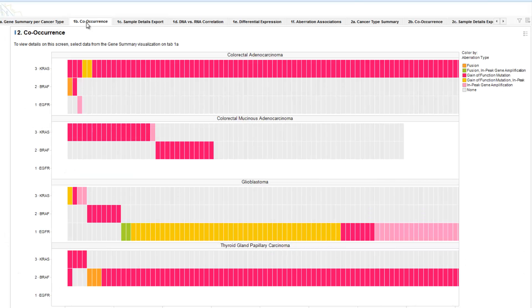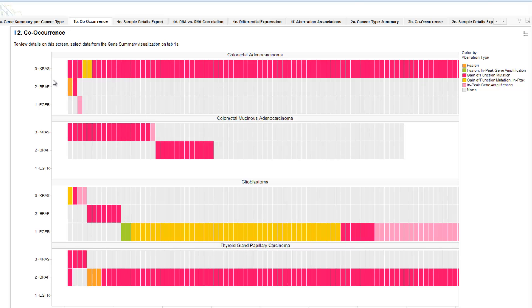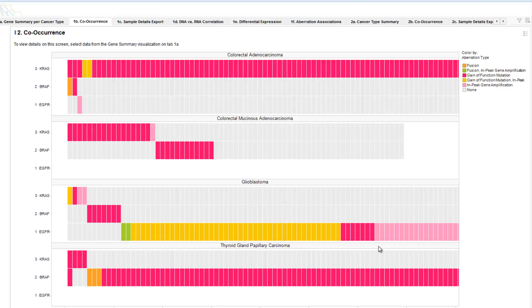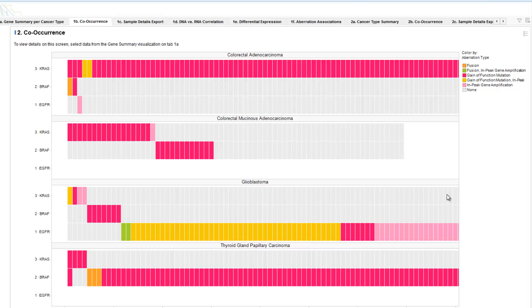Selecting the co-occurrence tab, we can now see across the cancer types that we selected, specific aberrations as indicated by the color for KRAS, BRAF, and EGFR on a per-patient basis. We can then see, for example, KRAS mutations and other aberrations are mutually exclusive with BRAF and EGFR in glioblastoma. We can also identify EGFR gain-of-function mutations as well as in-peak gene amplifications co-occur, as indicated by this gold color. This view gives us the ability to identify subpopulations, look at mutual exclusivity, and co-occurrence to better understand the populations that we're seeking to treat.